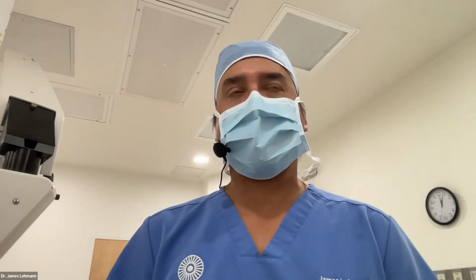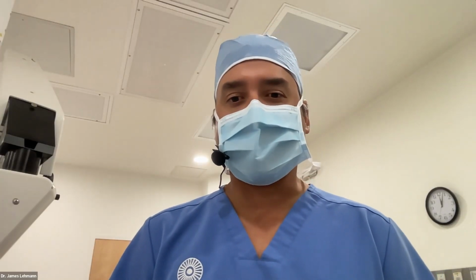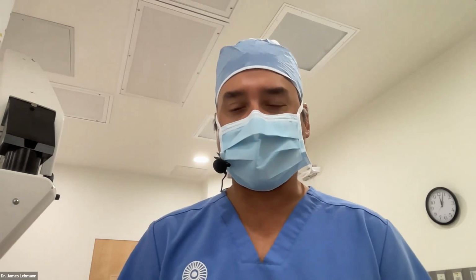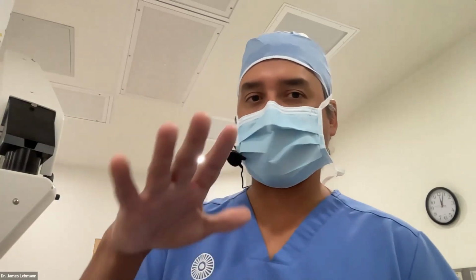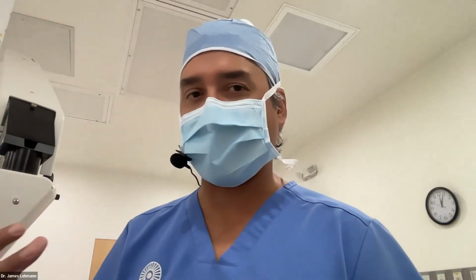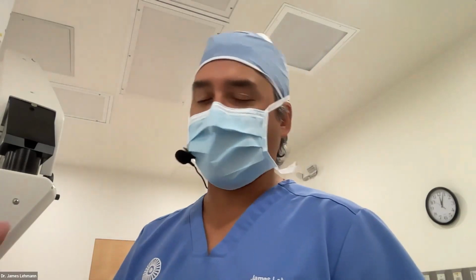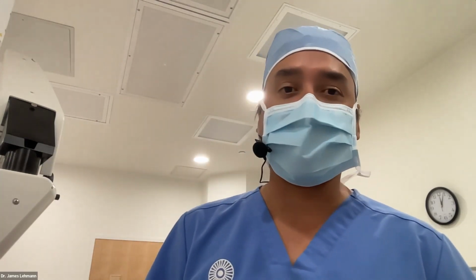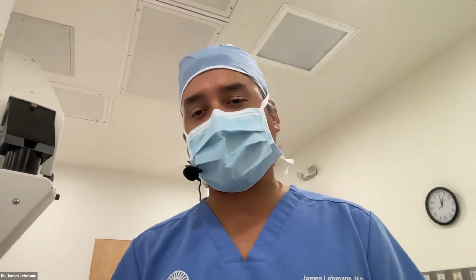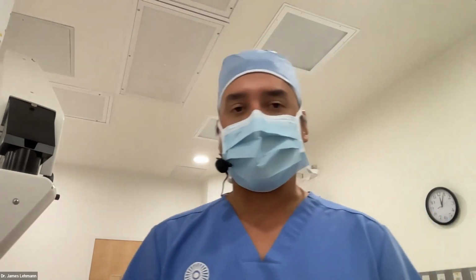Yeah, I think that if you have a tear in the posterior capsule, giving acetazolamide afterwards is a good idea, because a lot of them have high pressures. When you have a tear in the posterior capsule, you're putting extra OVD to manage vitreous prolapse, and you're going to put a lens in. Sometimes you can't take all that viscoelastic out because it's behind the lens now. So if you had a rupture in the posterior capsule and they don't have allergies, give them 500 of Diamox after surgery. After PKs, a lot of doctors routinely give acetazolamide as well. Not DMEK and DSEK, but PKs. So I think for a routine cataract surgery it's overkill, but for a complication or for a PK, I think it's reasonable.